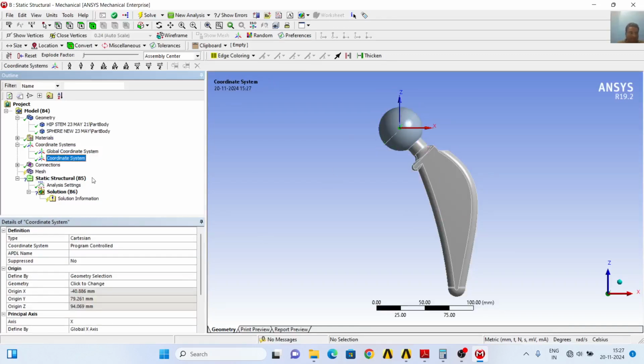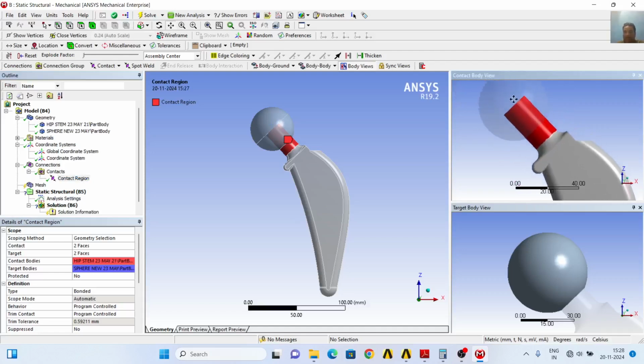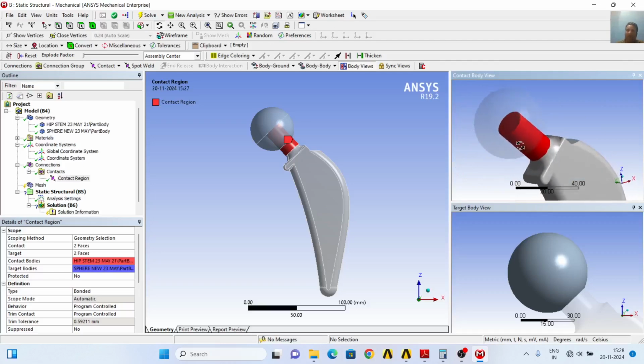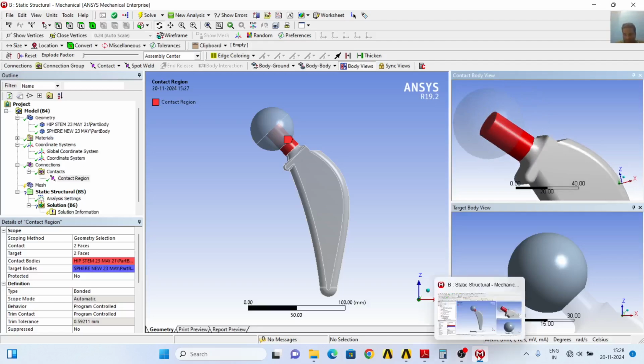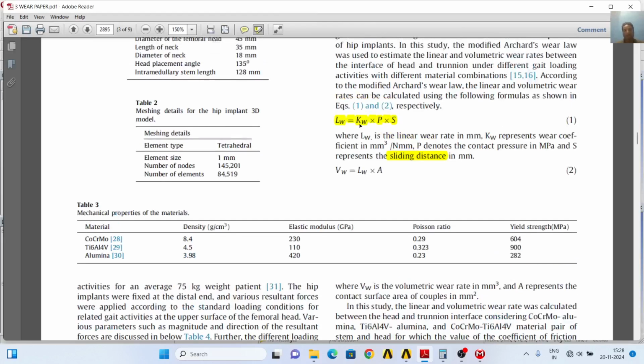This is in the head, and now I will define the connections. You can see the contact region clearly here. This is the contact body in which we will perform the Archard wear analysis. So you need to know about this surface area as well for calculating the linear wear. You need to know KW into P into S: wear coefficient, contact pressure, and sliding distance.